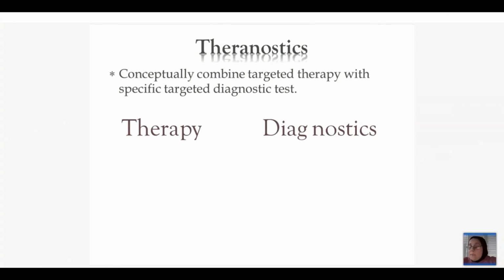Okay, I would like to talk a little bit about theranostics because I feel it's very important, and neuroendocrine tumor is one of the big tumors that we are using theranostics in. And actually, it's not a new technique. We've been doing that for decades in nuclear medicine, but the name, theranostics, is a new fancy name for that technique. What is the concept of theranostics?